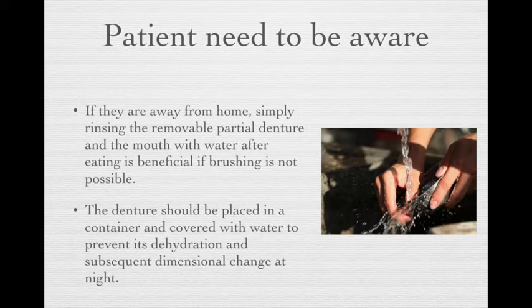It also may create the dimension change of the denture base. So always remind the patients to put the dentures into the water before they go to bed. And the water temperature should be just regular room temperature. Never put them into hot water, because the higher temperatures will also create distortions of the denture base material.